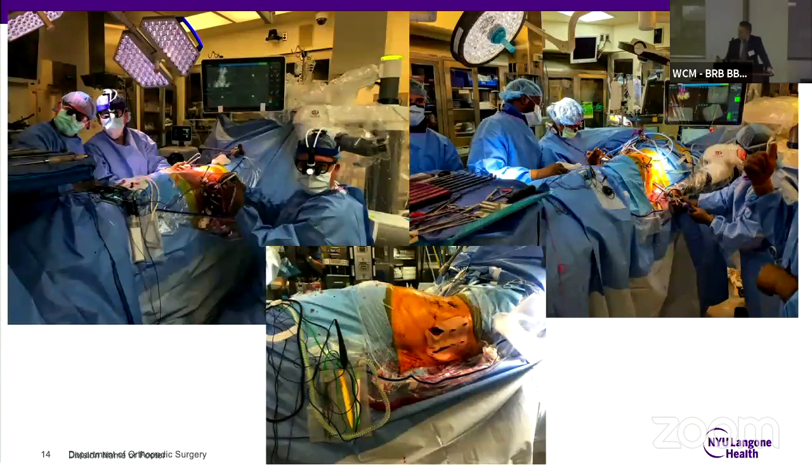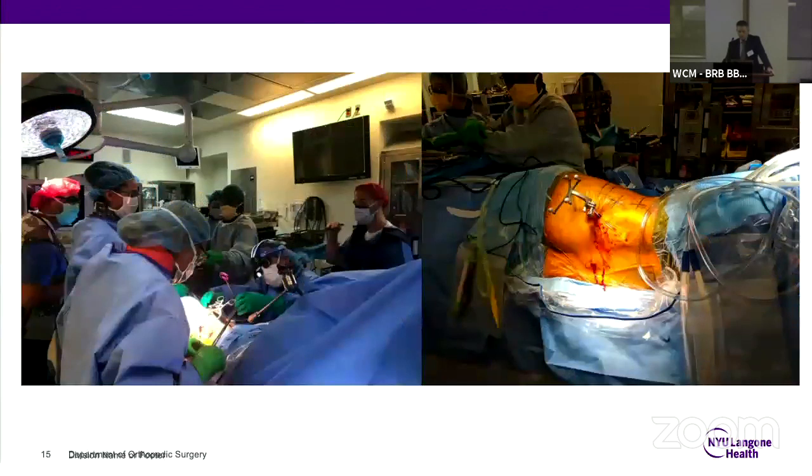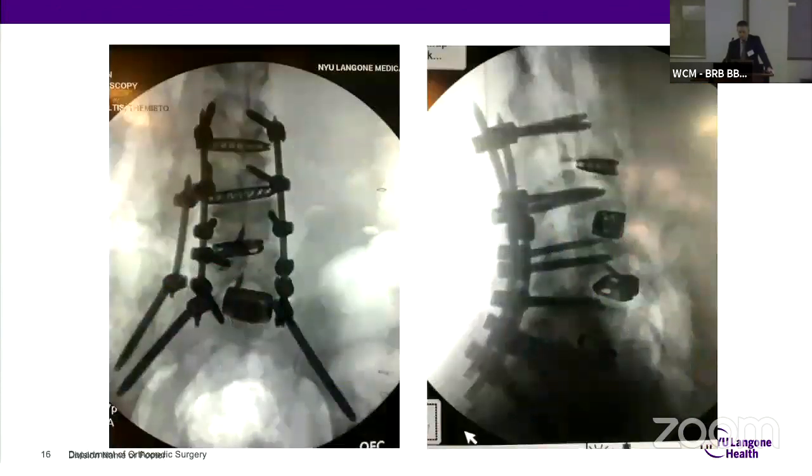And for this particular case, we used preoperative CT. We verified with an intraoperative fluoro. I got all the screws in before we changed any of the anatomy, so the accuracy was good. And then once the ALIF was actually exposed at 4-5 and 5-1, went over, did the ALIFs, and then finished with two laterals, closed the wound simultaneously, minimally invasively.